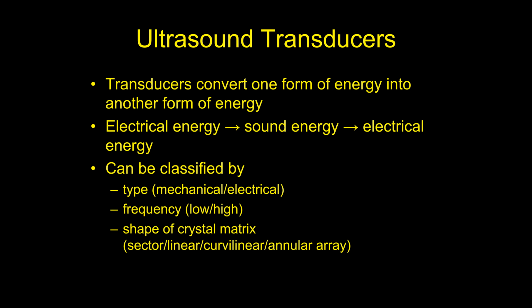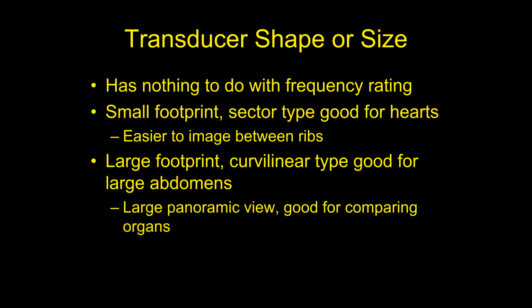Okay, ultrasound transducers, all of them now, are what's called electronic transducers. When they're on, you can't feel that they're on. You have no idea they're on. They don't vibrate. They don't do anything. They don't get hot. Okay, you don't know they're on until you would touch them against the skin of something and see if it makes a picture or not. All of these machines, you can freeze or pause the picture and save it. And then you would unfreeze it or press that button again, and then that probe is active, making sound again. Okay. And then it will make another picture.